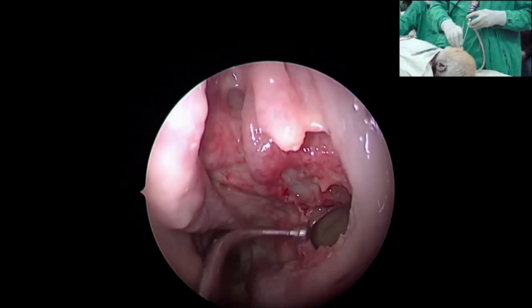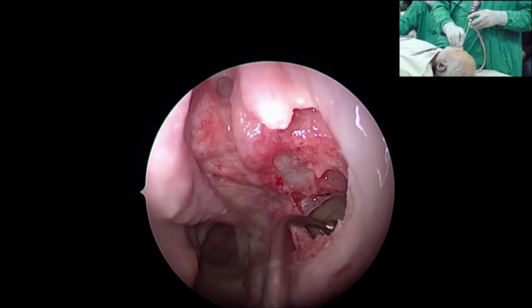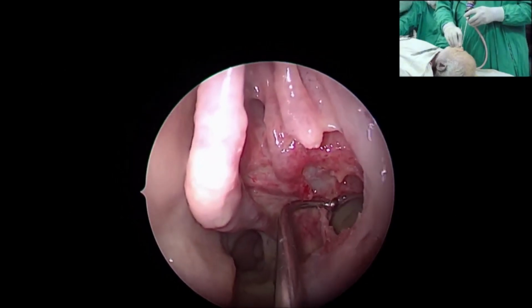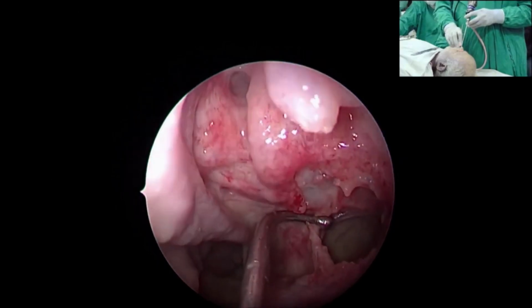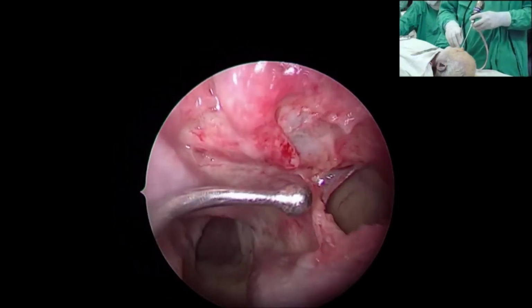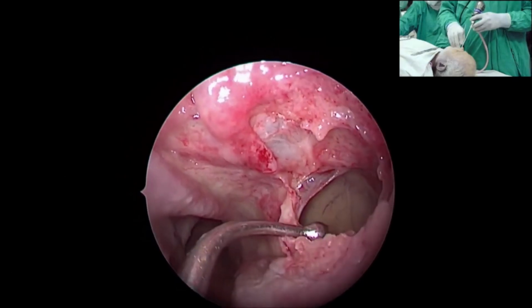So nowadays, for different indications, we need to enlarge and give a mega middle meatal antrostomy. Like I have extensive fungus which requires long-term surveillance. I need to enlarge this, not only for surveillance, but for introduction of my steroid solution or other solutions in the post-op period. So we create a mega middle meatal antrostomy.